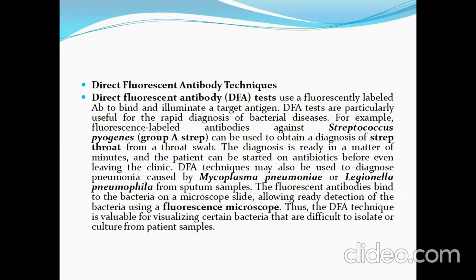Okay, so DFA techniques may also be used to diagnose pneumonia caused by Mycoplasma pneumoniae or Legionella pneumophila from sputum samples. The fluorescent antibodies bind to the bacteria on a microscope slide, allowing ready detection of the bacteria using fluorescence microscopy. Thus, the DFA technique is valuable for visualizing certain bacteria that are difficult to isolate or culture from the patient sample. So it is a very easy and ready diagnosis of certain antigens or bacteria in a patient sample. So it is a very efficient technique.